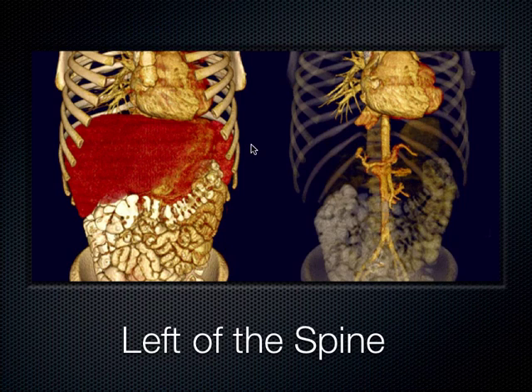This is a really cool CT scan, 3D rendering with the organs on, with the organs off. Very cool technology, I agree. The cost of 500 chest x-rays in radiation. Here is the aorta coming down the left side of the body, correct? Here's the heart. So after it comes out of the chest into the abdomen, that's when you can see it. You can't see it up here in the chest with ultrasound. That's one of the limitations of ultrasound. You can't see a thoracic aorta, but you can see the abdominal aorta very, very easily. You just keep pushing down until the spine shadow comes into play.